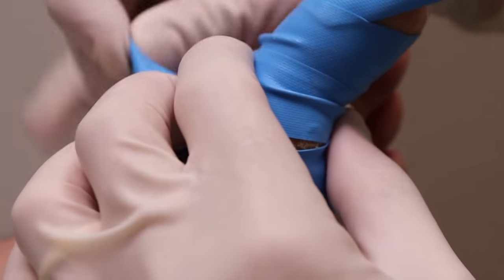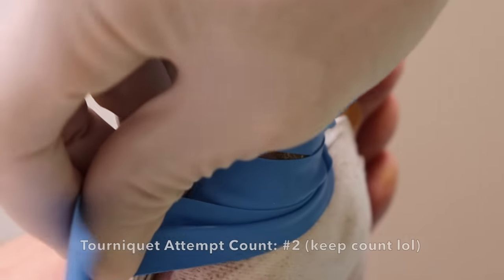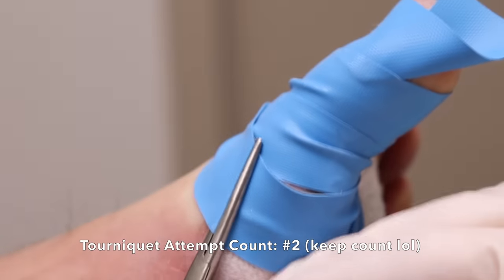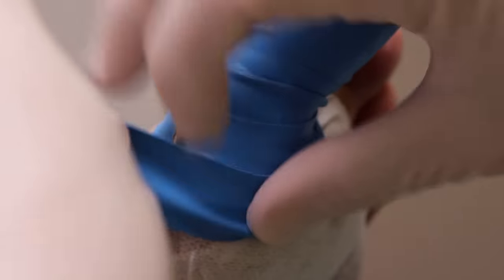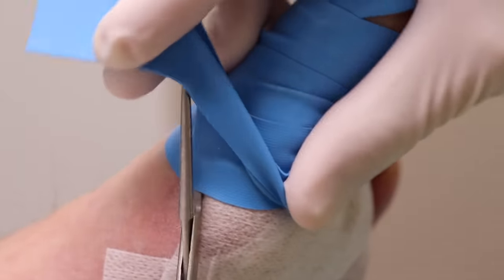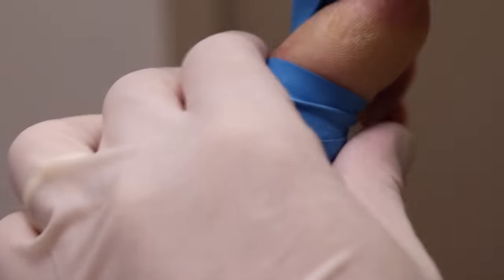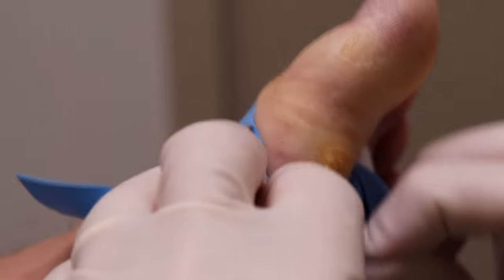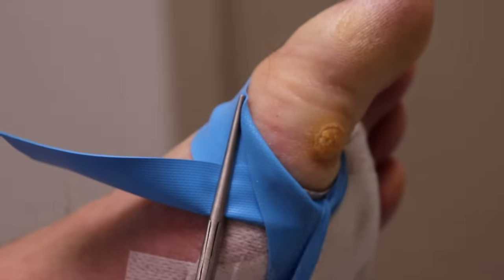Because I used something called epinephrine in the injection, there will be reduced bleeding. Hopefully it's good enough. If not, I might just have to throw on the tourniquet for a second, take it off, then check again, and put it back on. I'll also use acid, which should be applied in a relatively bloodless field.